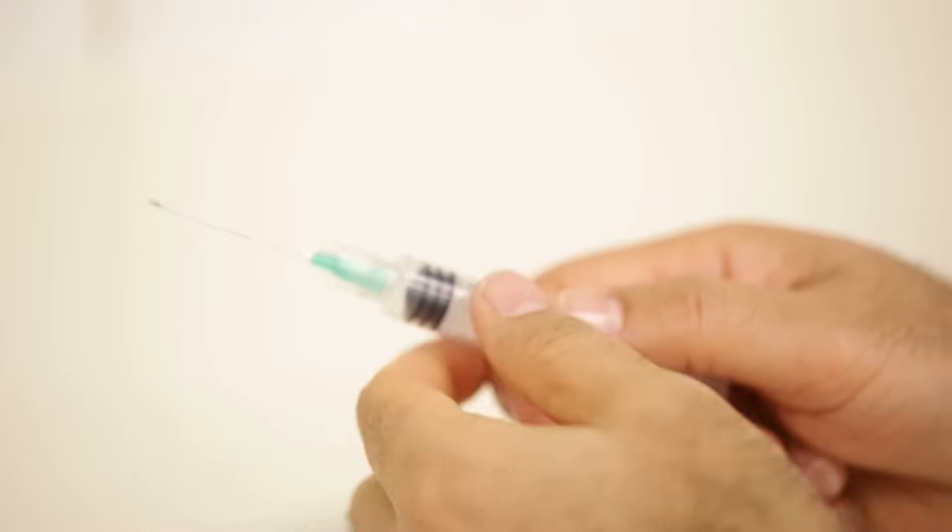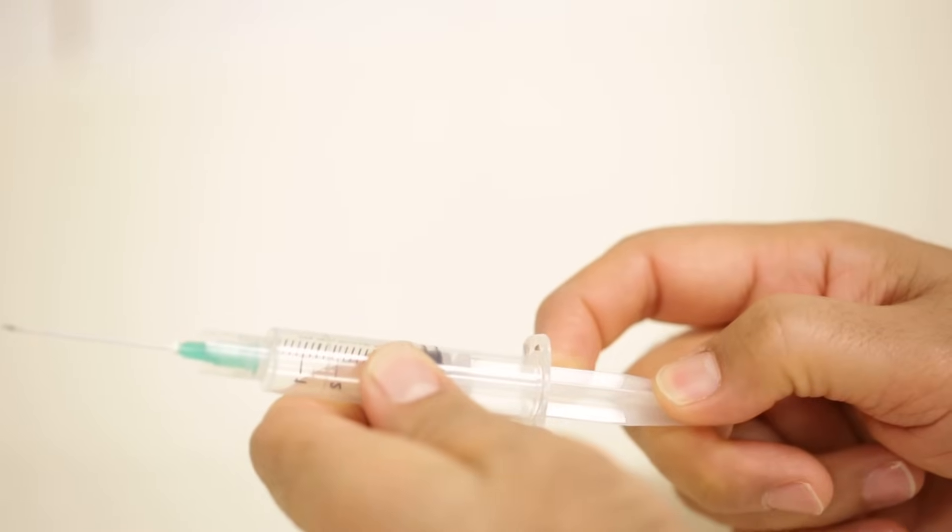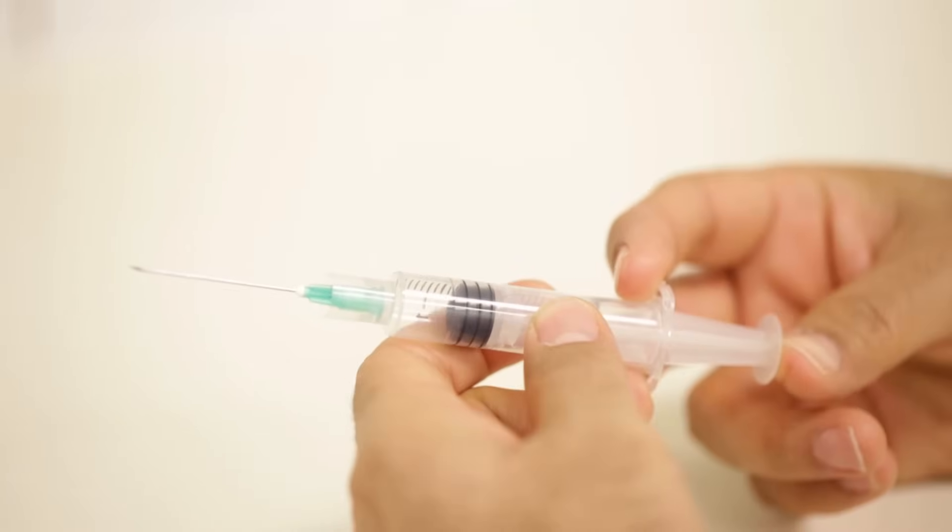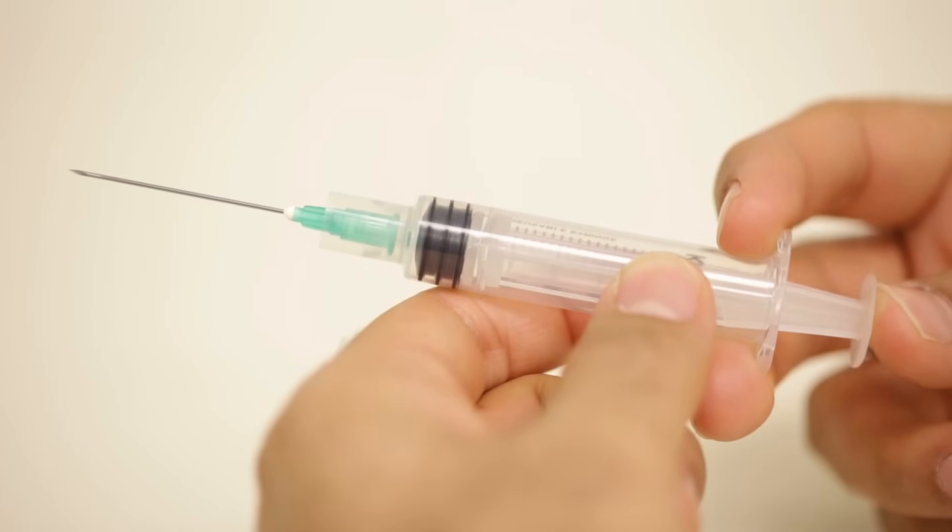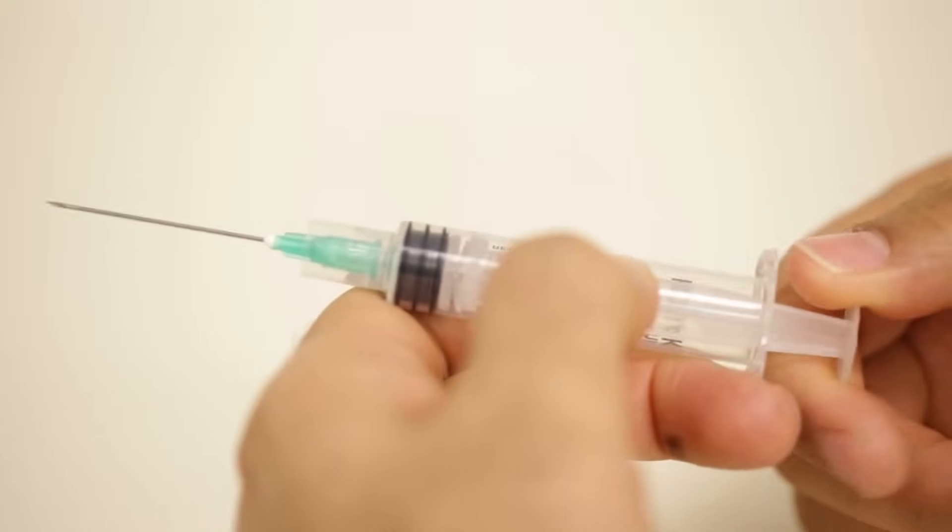This is a syringe with a reuse prevention feature. Continue to push the plunger forward. You will feel a bit of resistance towards the end of the barrel. Continue until the syringe is locked.